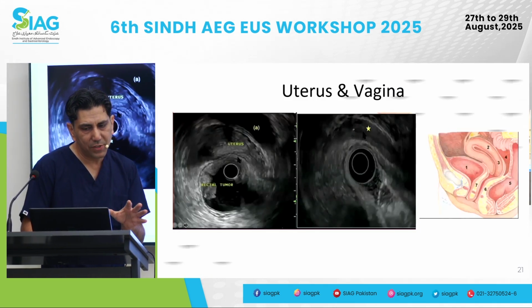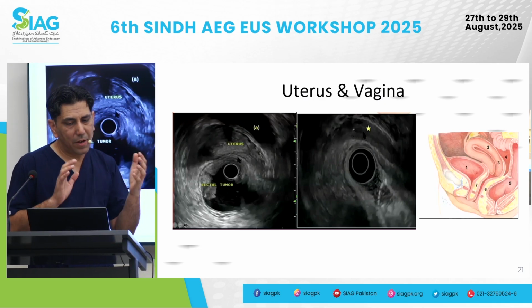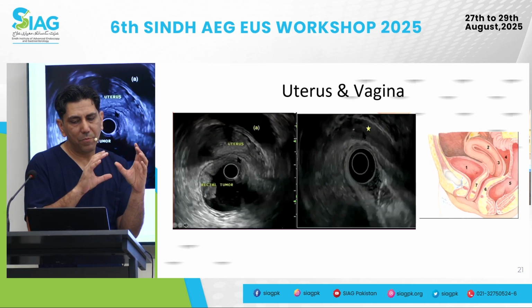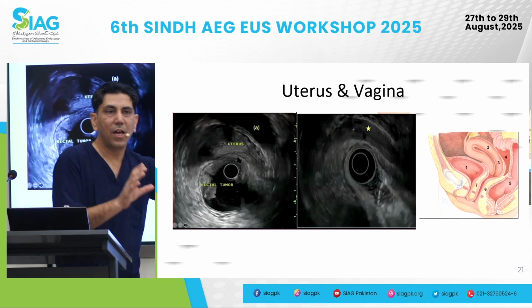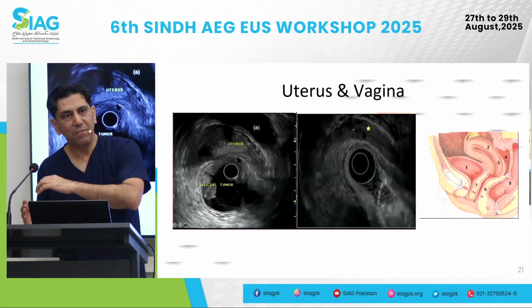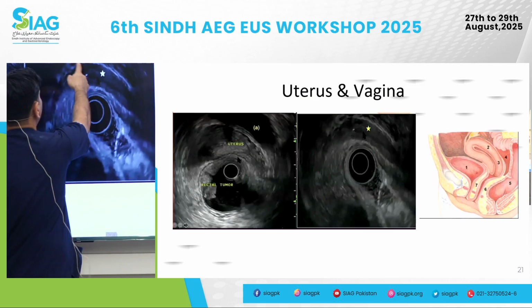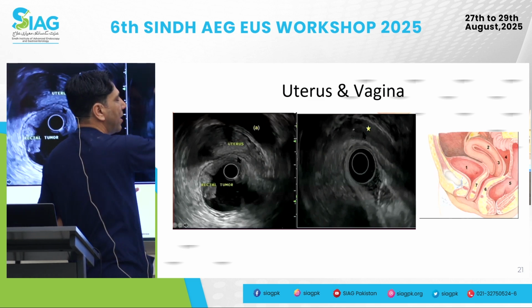Now, the difference in the female patient, because the prostate is a bean-shaped structure, whereas the uterus that you're going to see depends on what cycle the patient is in. Is it a young patient? Is it an old patient? Have they had a hysterectomy or not? It may give that elliptical shadow, but it then tends to balloon away from us, so it completely merges and you can't identify the boundary.